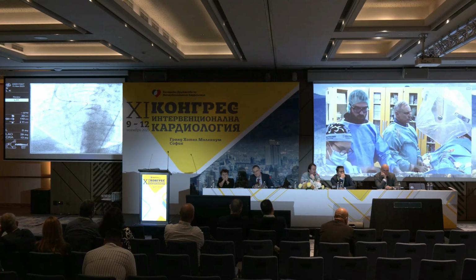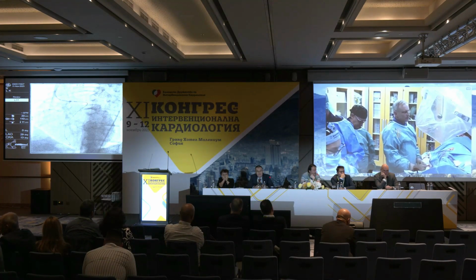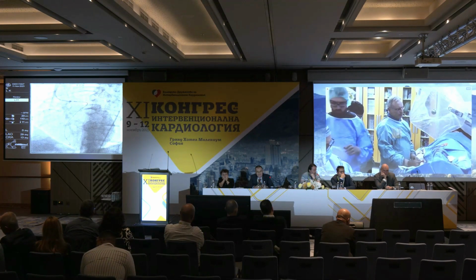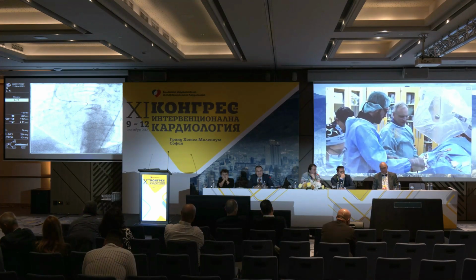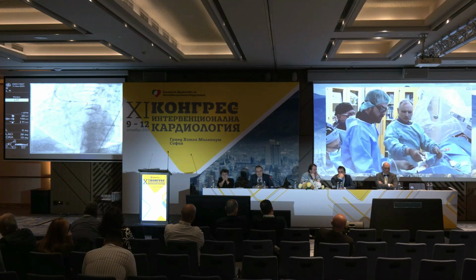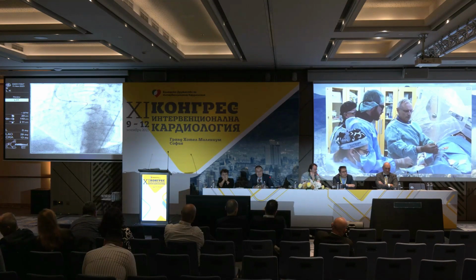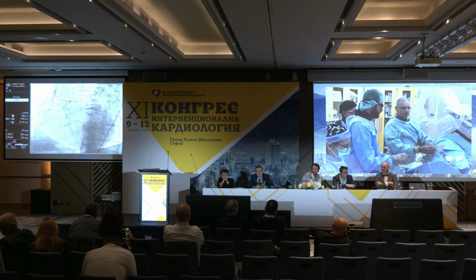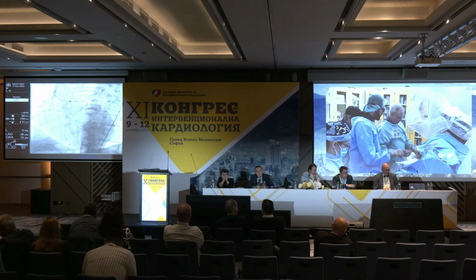So more straightforward PCI. So you see that in this complex case, with the retrograde techniques, never rush. That's at least my approach. That's my experience. But you are very fast. So I don't know. Yeah, but rushing doesn't mean time. Rushing means mental orientation.